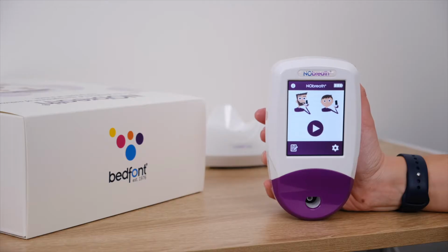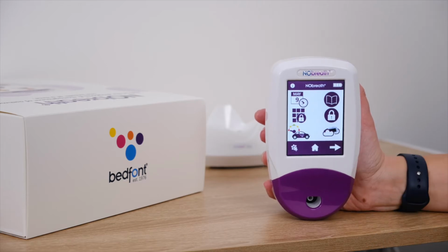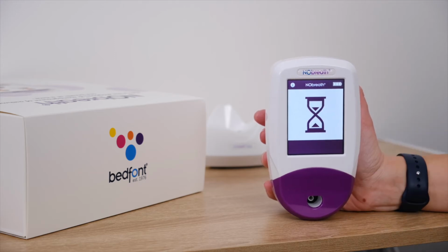The NObreath FeNO Monitor has an ambient monitoring mode which enables you to check ambient levels of NO. To begin an ambient NO test, press the menu button. Then select the ambient test icon. The NObreath monitor will automatically begin sampling the environment and a reading will appear on screen.